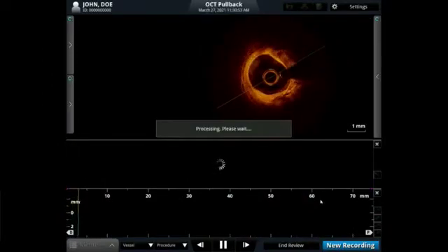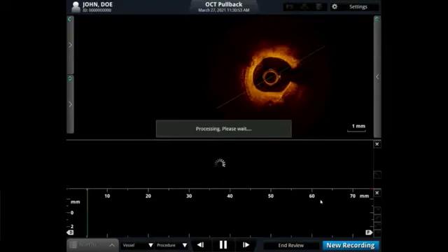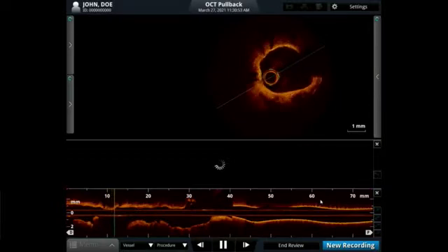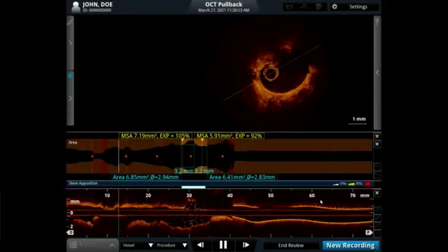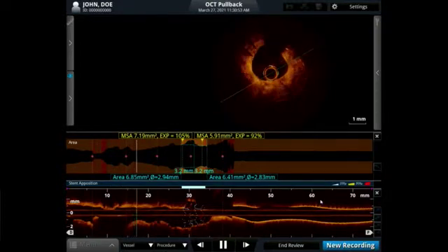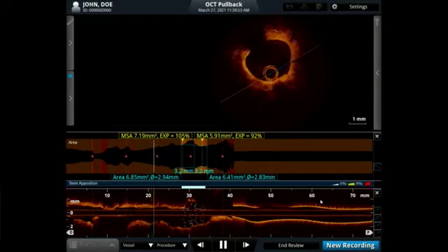So that was on 75, was it? I did it on 75. Yeah, great. Very nice. Good clearance. Okay, very interesting. So it's beyond the stent, isn't it? It's right beyond the stent. I agree with you. The brachytherapy worked up to that stent, right? Yeah, it did, absolutely. Indeed. I have to make sure you know this is a 20-year-old technology now that's still the best post ISR. Absolutely.